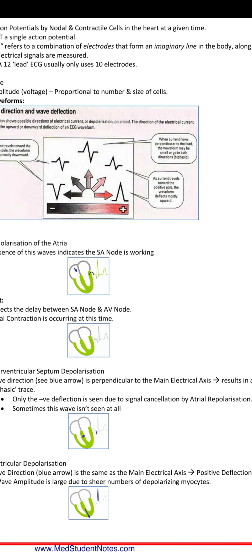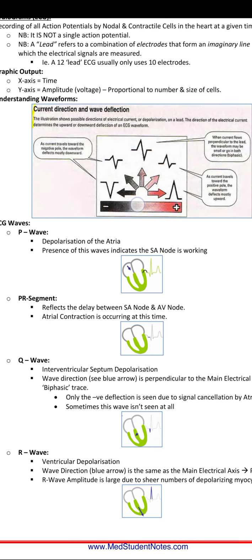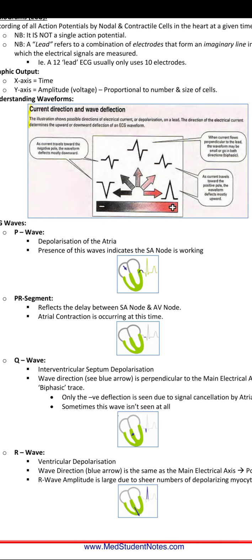In the P wave, the depolarization of the atria is occurring.